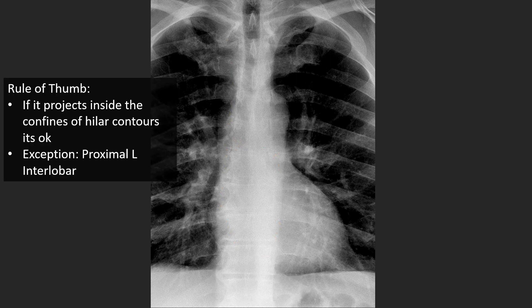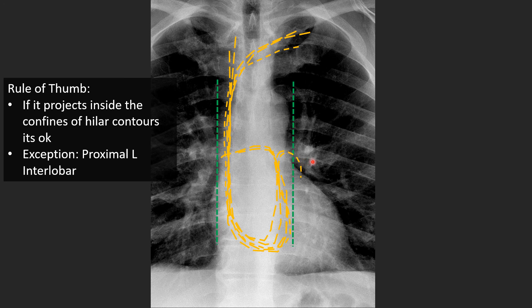As a good rule of thumb, if the catheter projects within the confines of the hilar contours it is generally okay. Here are the hilar contours and all the catheters we just looked at — for the most part these catheters project within the hilar contours within the proximal interlobar pulmonary arteries and the main pulmonary arteries. The exception is portions of the proximal left interlobar pulmonary artery, which can extend just beyond the hilar contour, and that's generally okay.